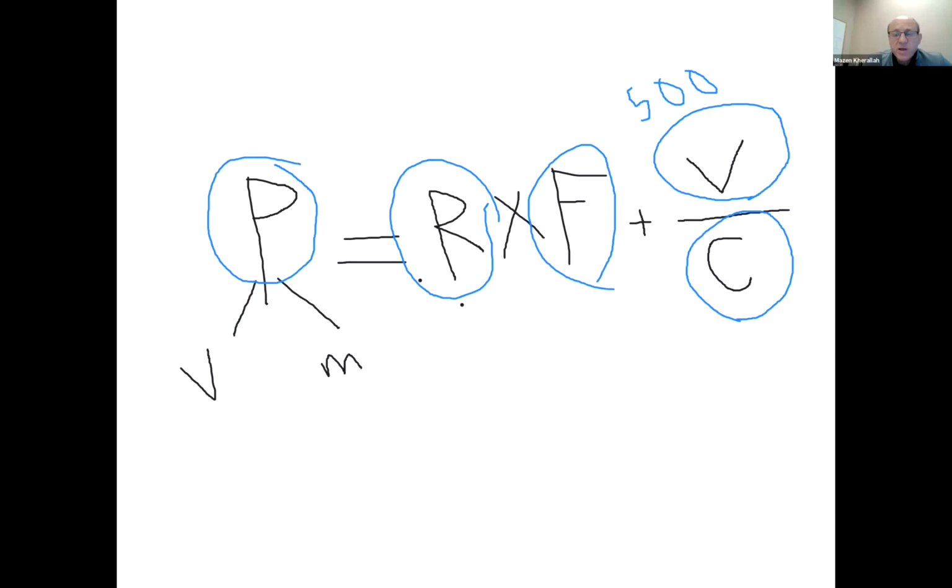And since this is a volume control, the patient can breathe. So he can participate in the generation of the pressure. And if the patient generates pressure here, the ventilator pressure will go down. The sum of the ventilator pressure and the muscular pressure, or the patient's pressure, would actually be equal to resistance multiplied by flow plus volume divided by compliance. So let's get the ventilator and apply this formula on the ventilator.